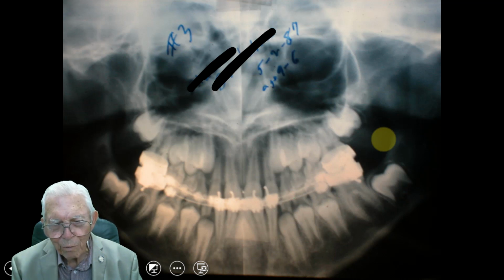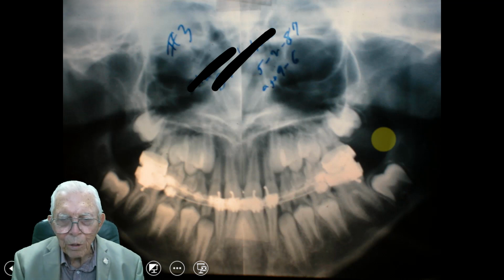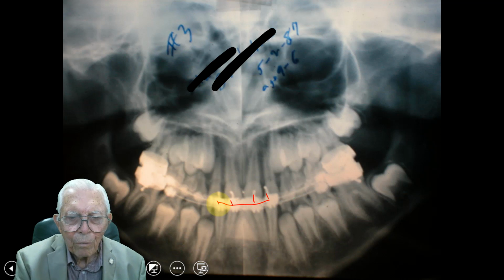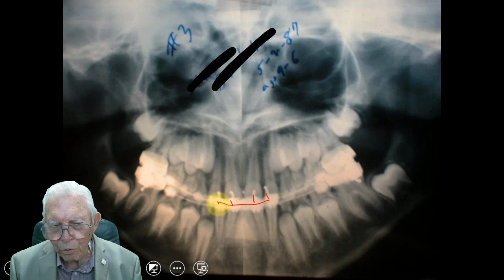And so you wear them for a good while, and you break the tongue thrust habit, but you need to correct the breathing problem on kids before you start doing that. So here we've got these tongue thrust appliances, and they're working on 4 anterior teeth. I had to have these bands on the lower teeth to solder those on.